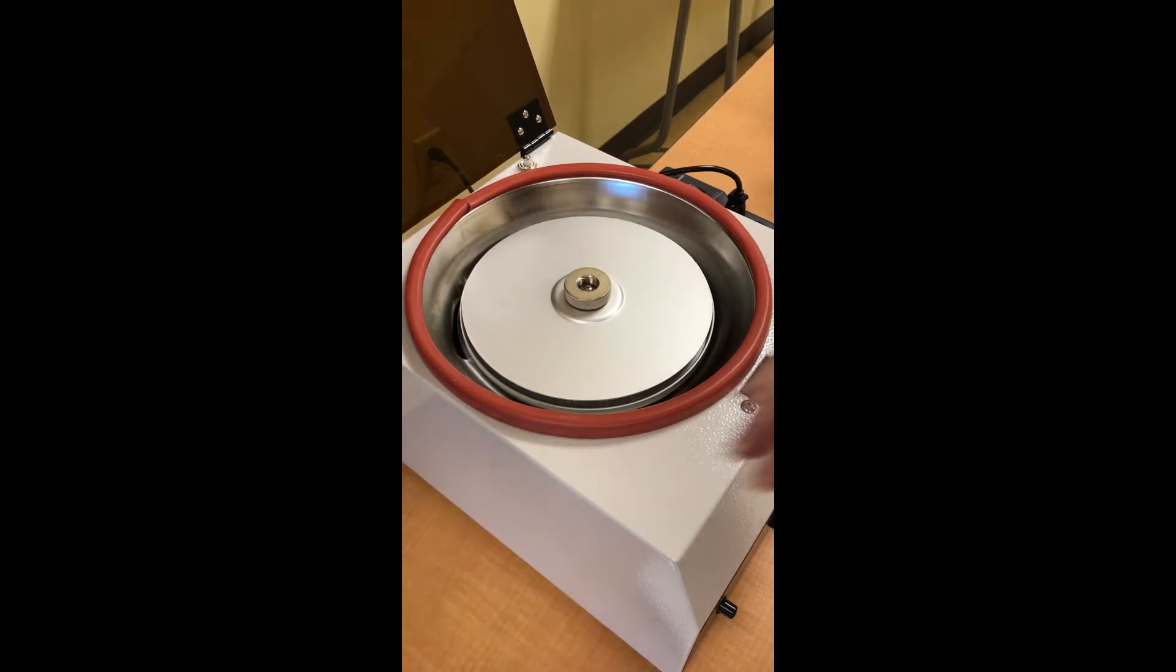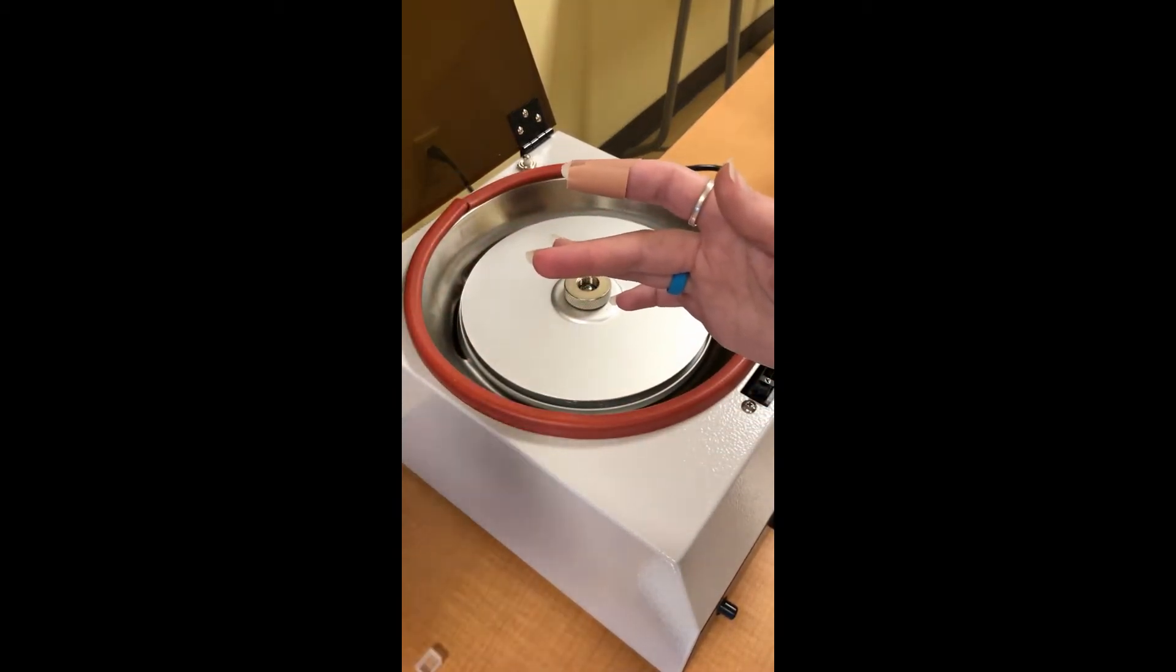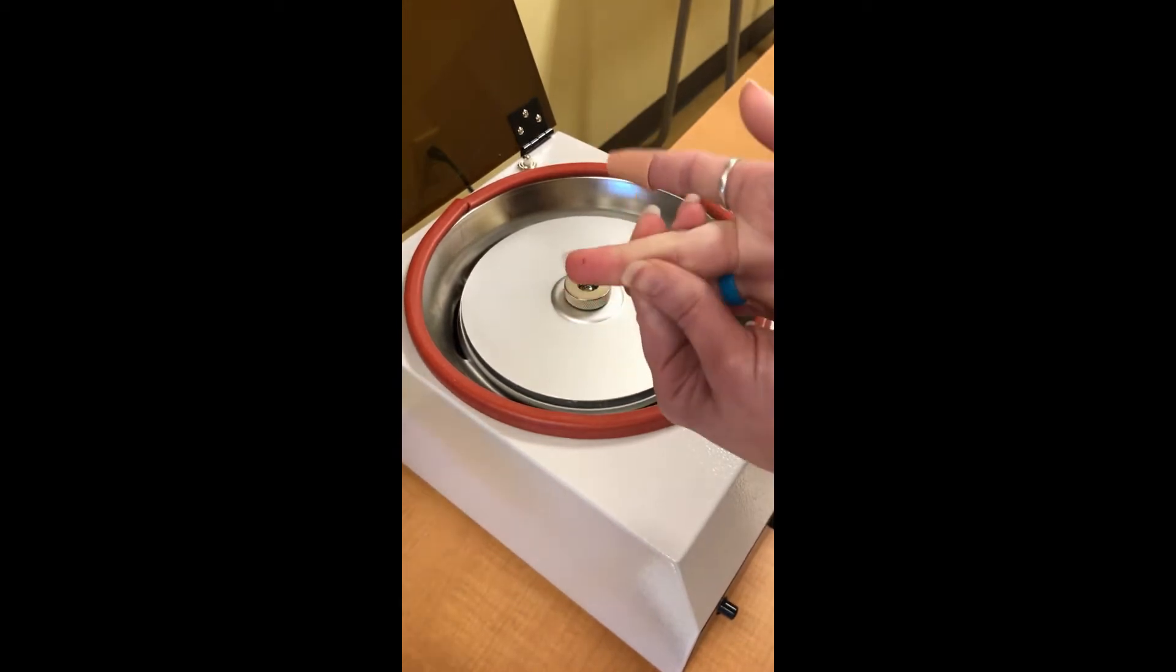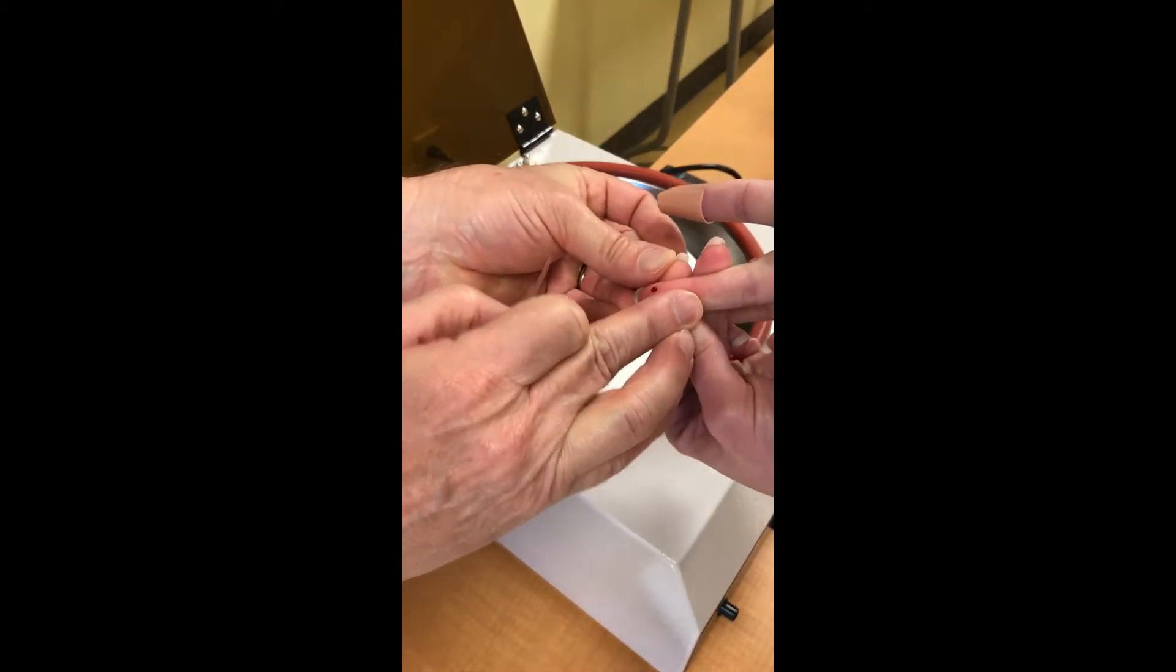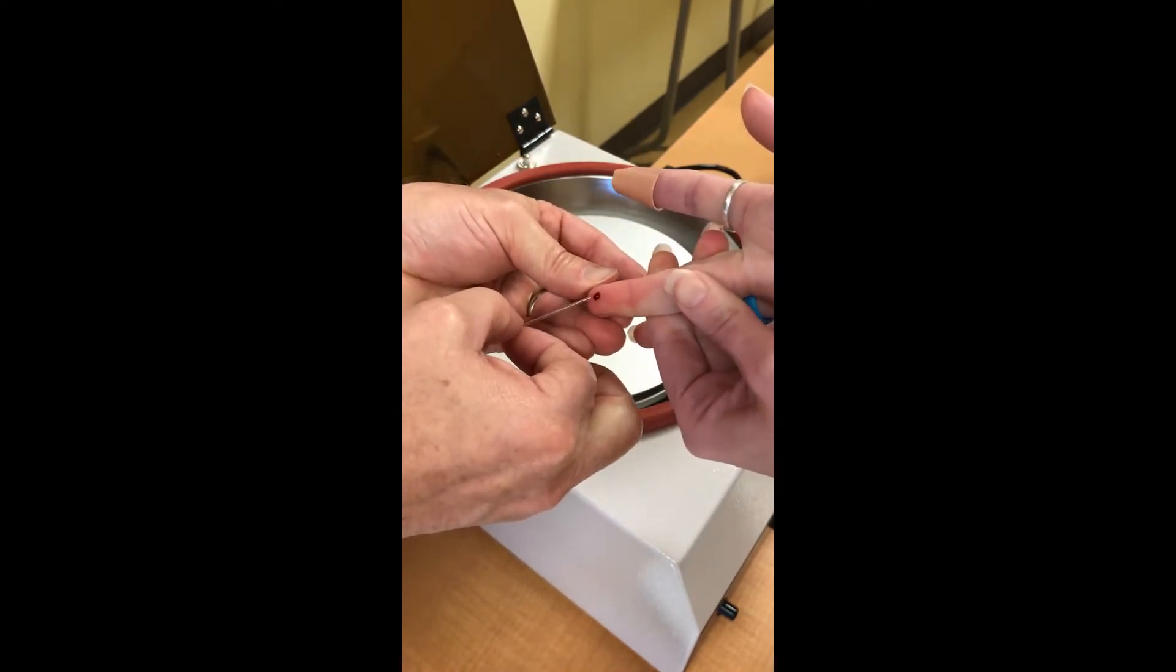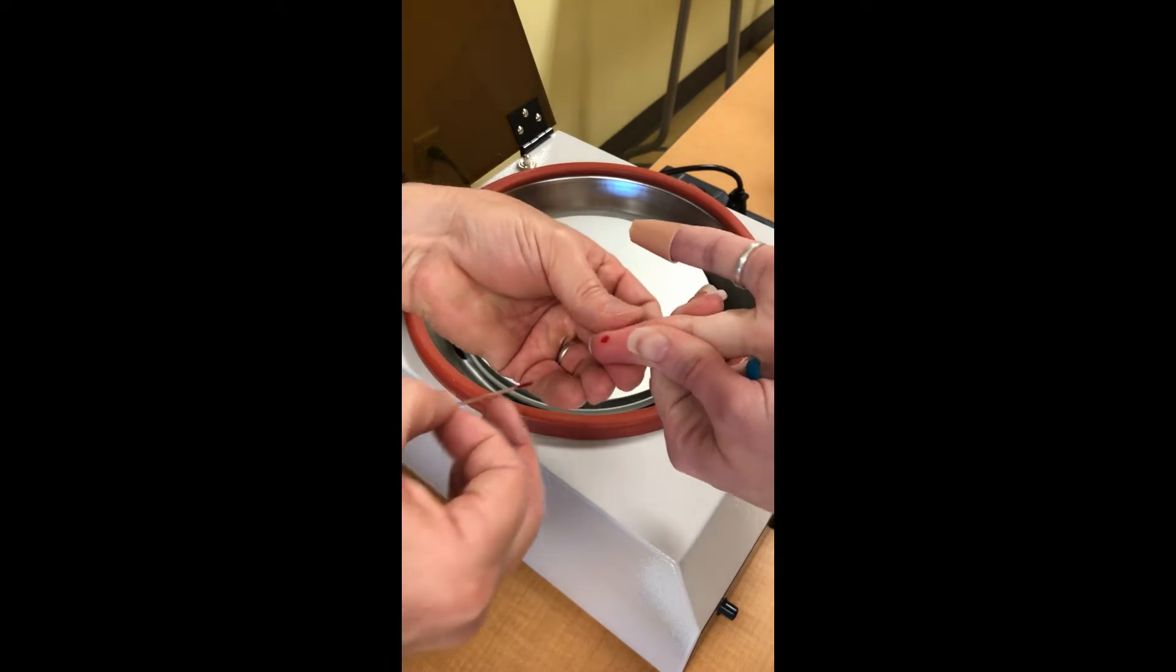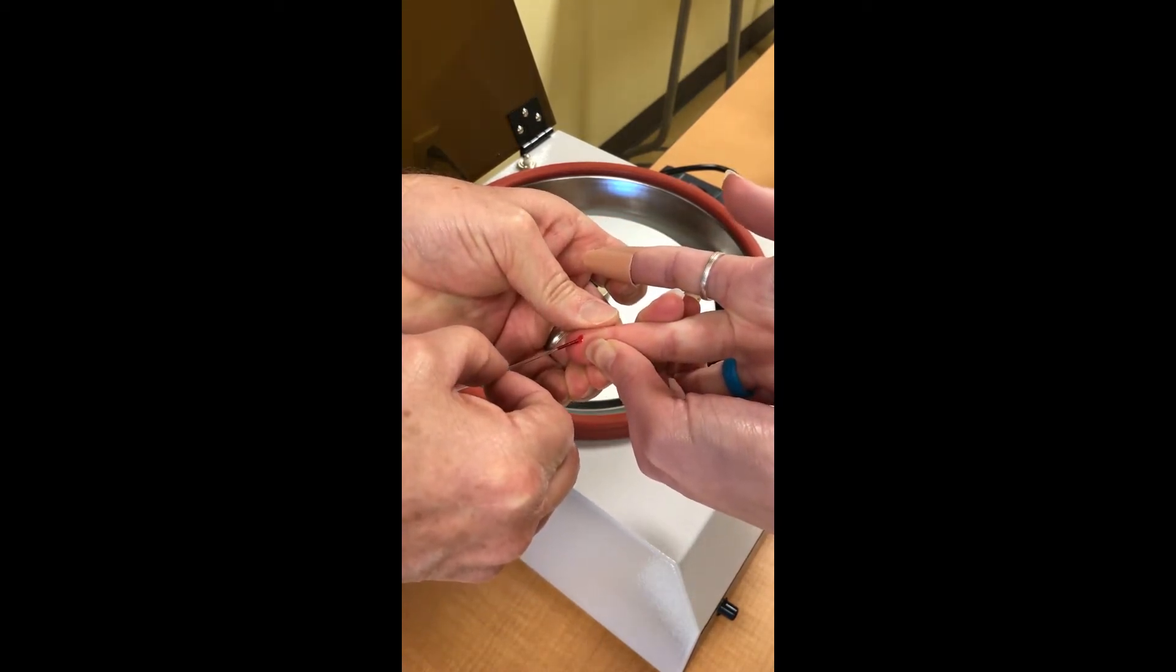All right, so now we're going to need just a little bit of blood to fill up our hematocrit tube. We've got a finger right here. Gonna need some blood. Milk it and get some drops out. Squeeze it good, get some blood out of there. Okay, and it'll just draw up into the tube when we touch. There we go. That shows you how much that was. Kind of squeeze it down - it's just like milking a cow right there. Draw it up into the tube.